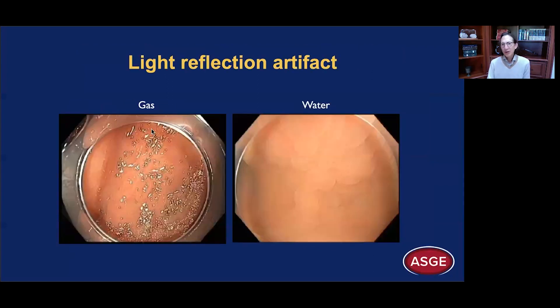Here you see an example with gas — you get this light reflection artifact. Underwater, it's gone, and you can see the fine detail. This is a SSA here; you can see the fine detail.